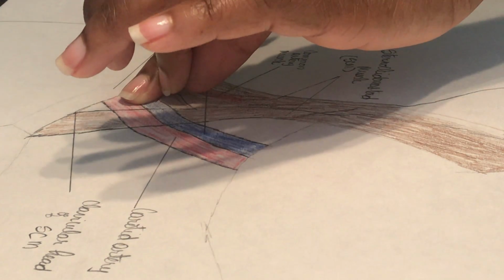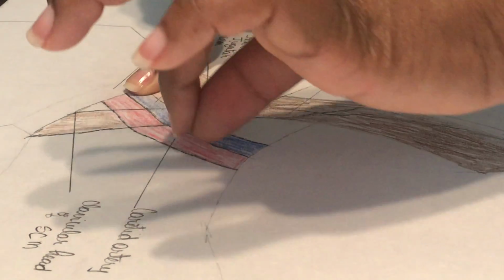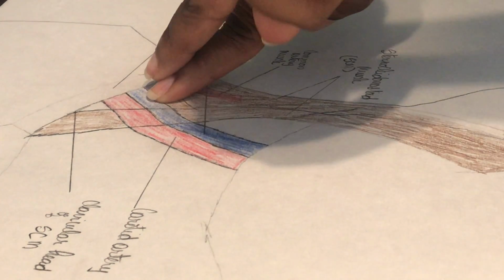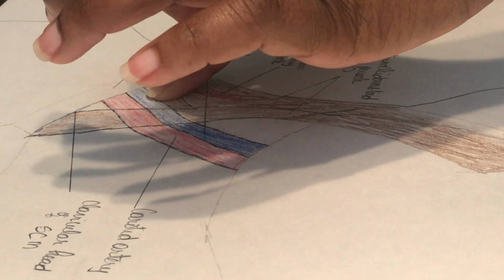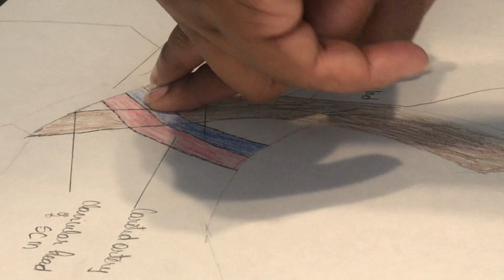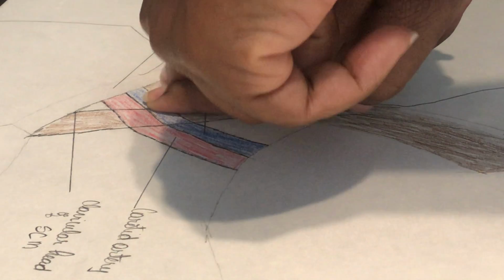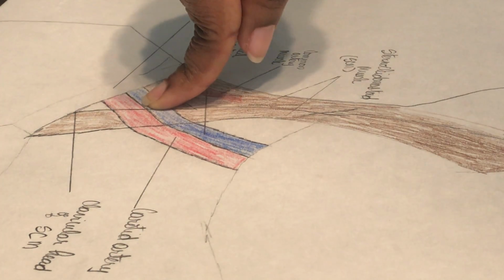Once the guide wire is a little bit advanced, we secure it with that non-dominant hand, and then we remove the needle. Then we use our scalpel to nick the skin, so when we advance our dilator, we don't get resistance. When we are puncturing the skin, the sharp part of the scalpel is away from the guide wire. I puncture the skin, and then I put the scalpel down.